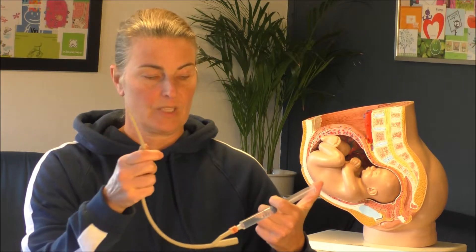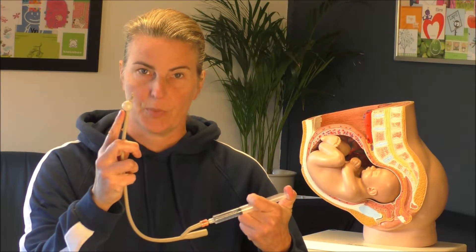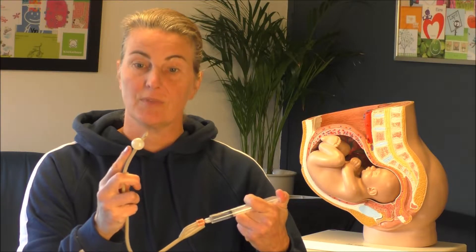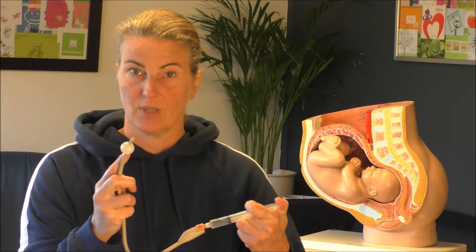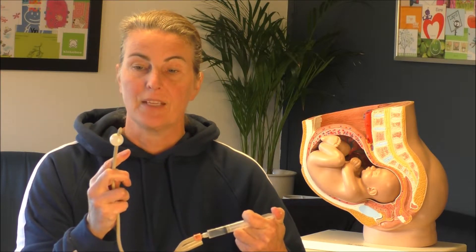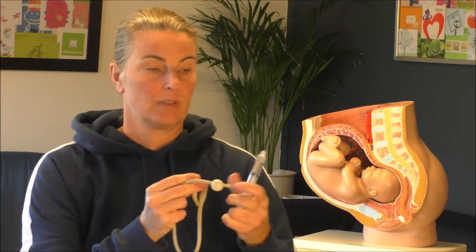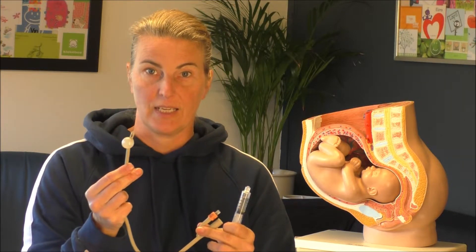They then bring in some water and you can see that the tip of the catheter will swell. They make it bigger and the gynaecologist will decide how big it's going to be. This depends on the softening of the cervix. When he thinks it's big enough, he takes off the syringe and the balloon stays inside of your body.